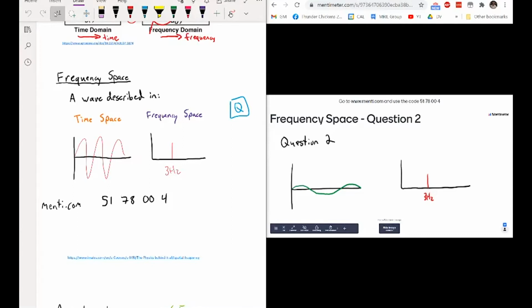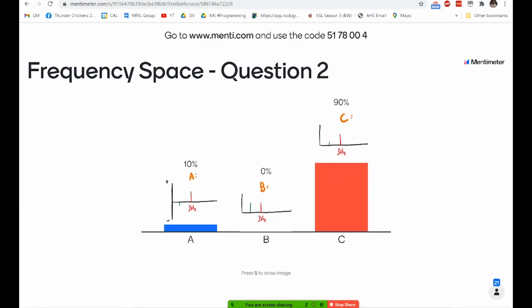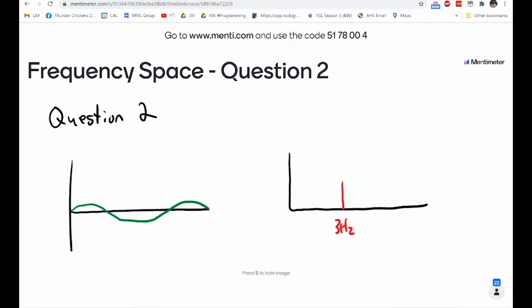All right, sweet. Let's say that's enough for this brief exercise. Let us check the answers for this one. Okay, yeah, again, largely correct. Great job, everybody. The correct answer here is C. So the reason for that, I'll just do the same thing I was doing before. The reason for that is our green signal is lower in frequency than red.